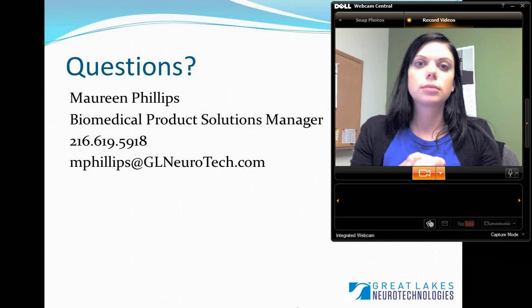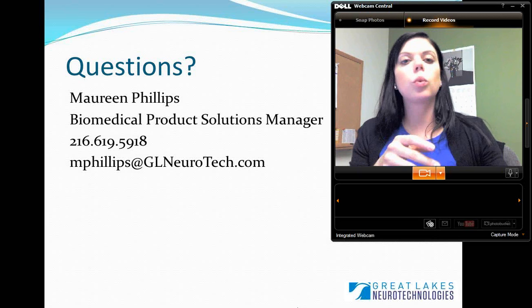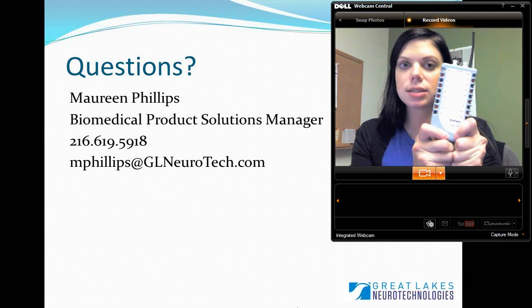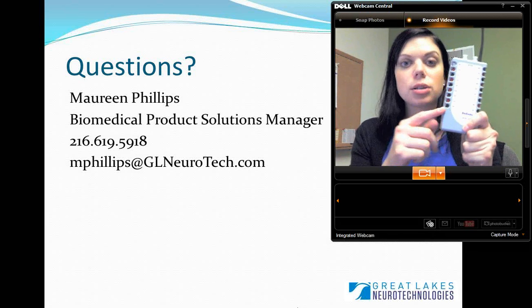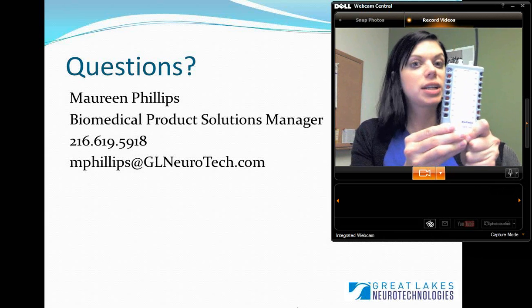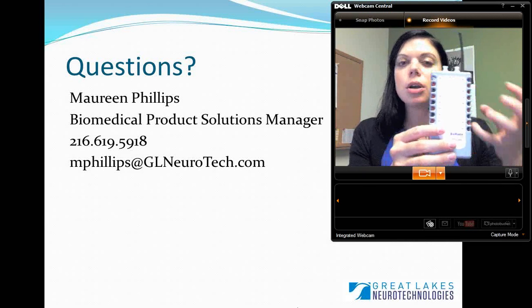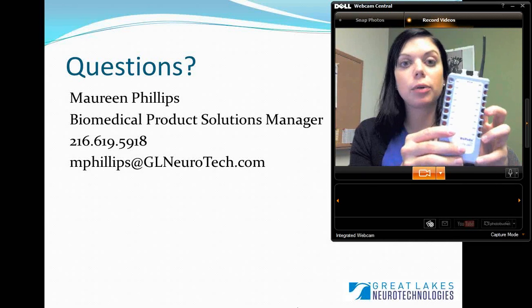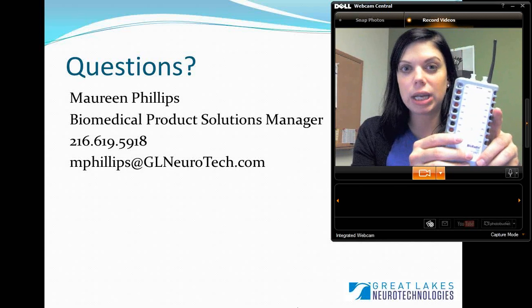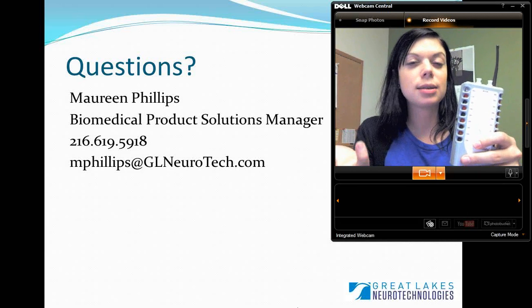Okay, I think we have time for one final question. Can the channel number be increased to, say, 16 or 32 channels? On one BioRadio device, you are limited to 8 channels, but you can collect data from multiple devices. So if you needed 16 or 32 channels, you can almost daisy chain multiple BioRadios together in order to do that. It may or may not work depending on the environment that you're recording your data in.